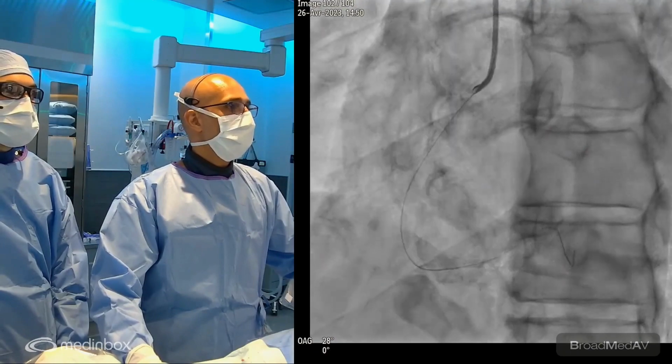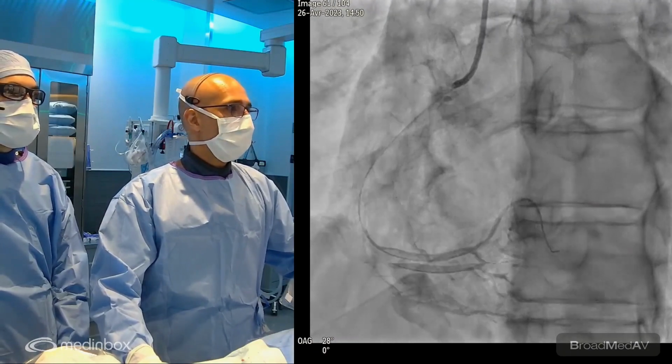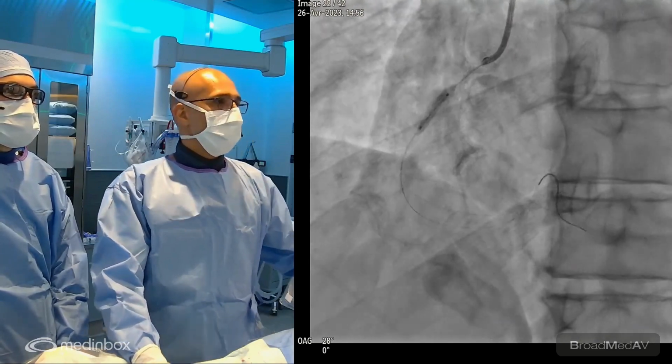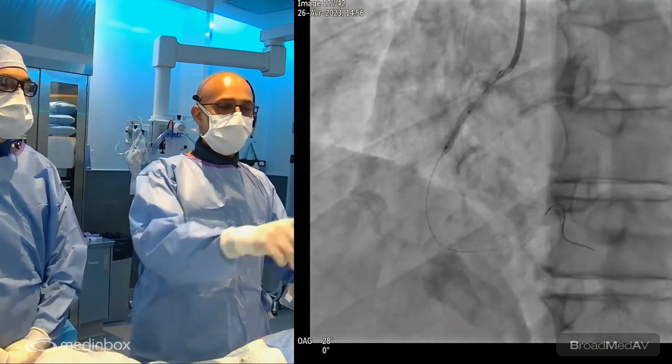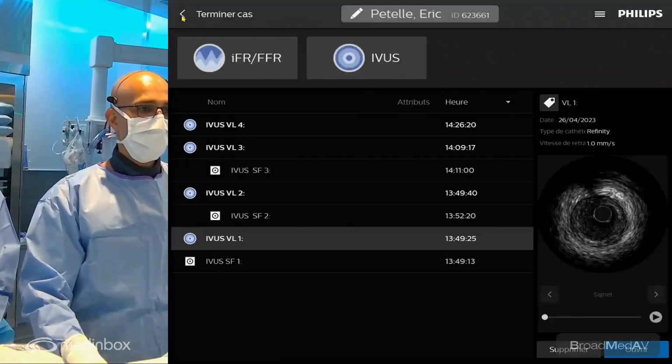We took an image post-atherectomy. We had some spasm in the PDA that would come back later on. Then I performed pre-dilatation, and we performed IVUS. So let's see the IVUS first, before the pre-dilatation. We measured 3.0 as a distal landing zone.